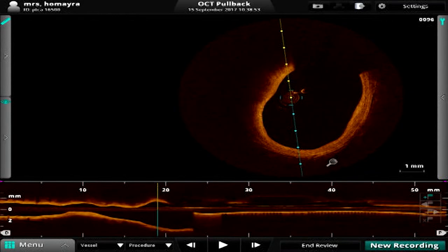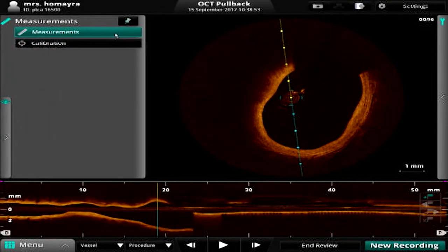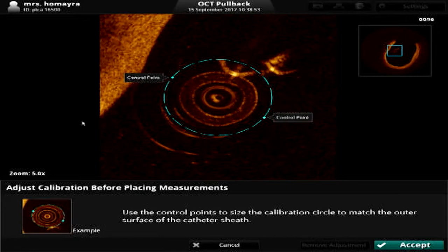Presence of positive functional tests previously as imaging tests, but routinely part of the patients come to the cath lab with ambiguous tests. So for me, this case illustrates the importance of having the capability to do FFR in your cath lab and verify your decisions functionally. I think that's very important. Yes, absolutely right. There's some sort of pre-planning and procedural physiology.